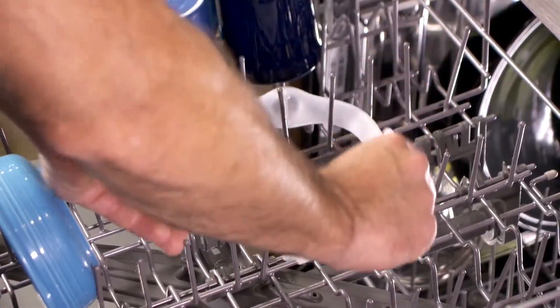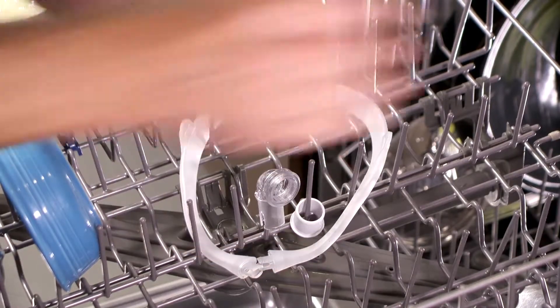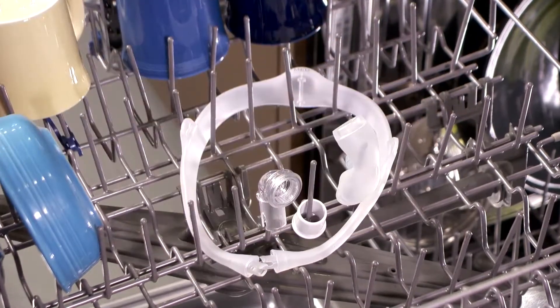In addition to hand washing, you can place the mask on the top shelf of the dishwasher for cleaning once a week. Choose mild detergents and use the air dry cycle.